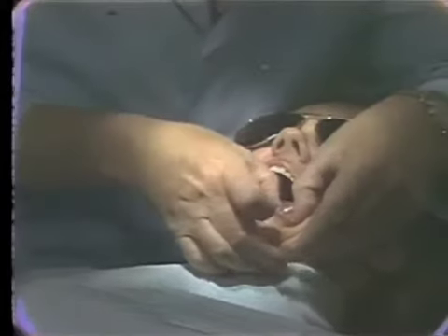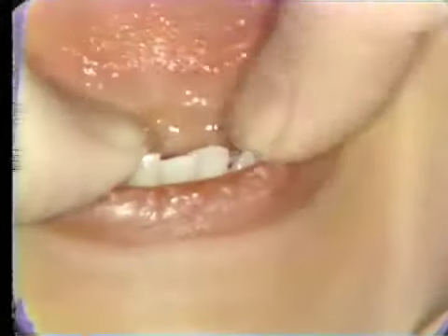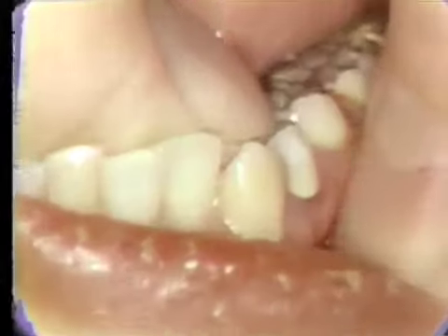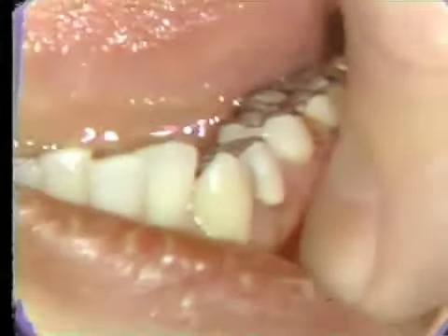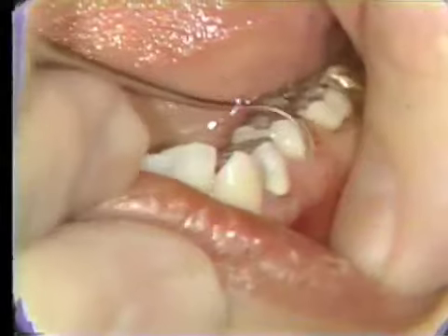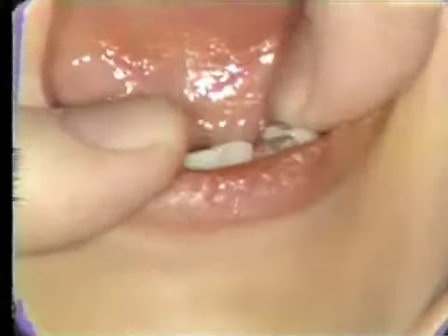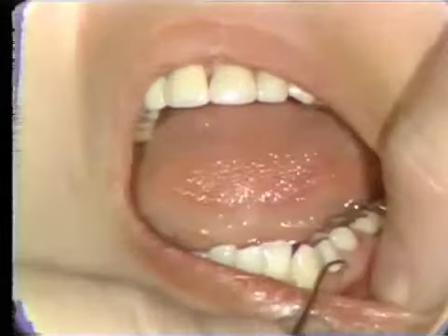In checking the restoration, you want to make sure that it goes down all the way. Make sure that it fits the tooth the same way as it fits the die. If your temporaries haven't been keeping the tissue out of the way, then you may have to retract the tissue. You want to check your contacts to make sure that the contacts are not holding the restoration up, but you can see what we're trying to do with this contour here now is to make a nice even contour for that restoration. So we'd go back and fit each one of the crowns to the area, opening up the proximal area so that we can have a good area for the gingival tissue.